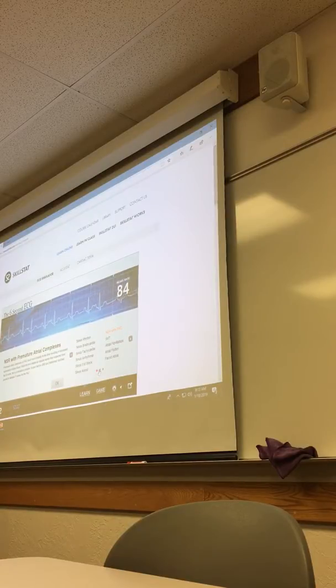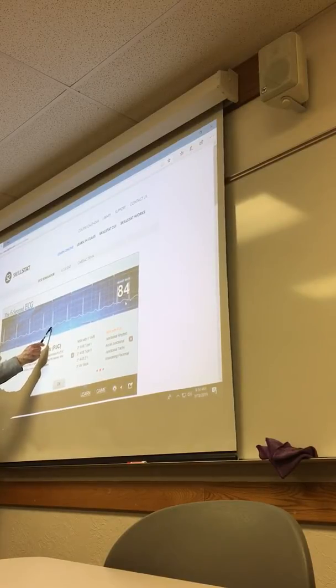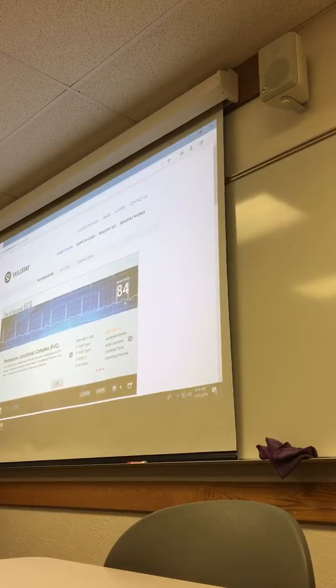I'm gonna jump ship here now, and we're going over here. Here's a premature junctional contraction. So what does NSR mean? Normal sinus rhythm. So we're in normal sinus rhythm, and then we have a premature junctional contraction. So again, P wave QRST, P wave QRST, P QRST. I don't have a P wave, but I have a very normal QRS. Okay, junctional. If it was wide, it would be below that junctional area. But it's narrow without a P wave, therefore it is junctional.